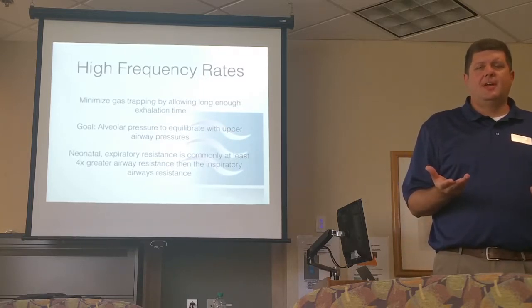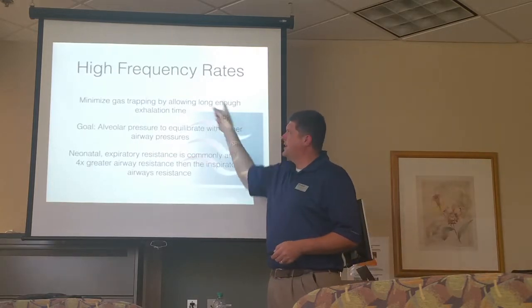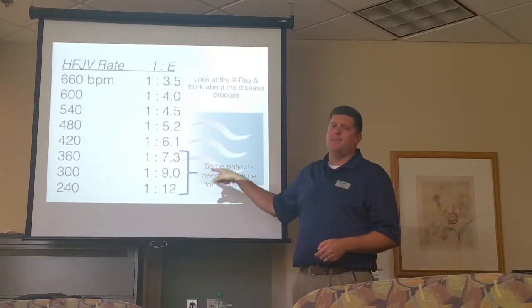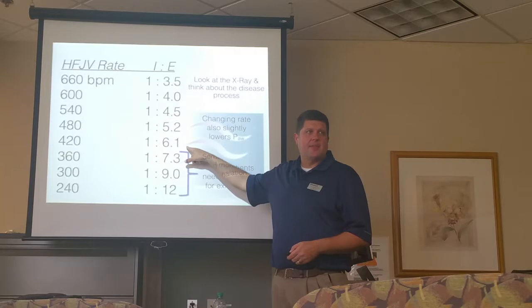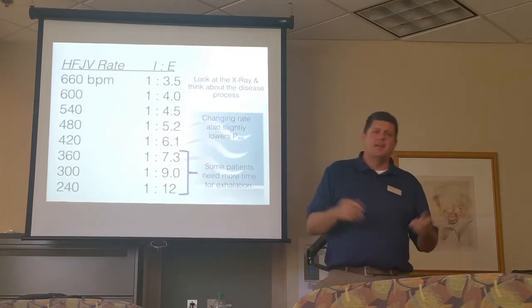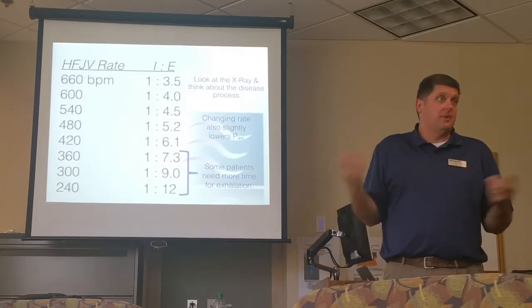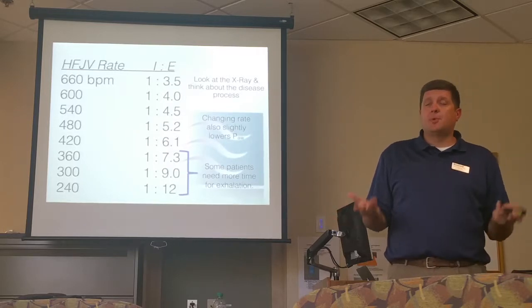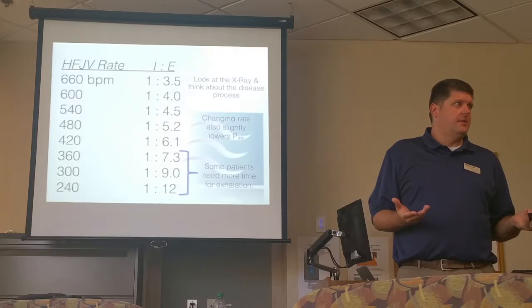Sure it does. Where the jet rate has an effect has to do with exhalation time. It has to do with making sure there's enough time for exhalation to occur. When you first turn the jet on, you're at this 1:6 IE ratio, right? It's just a middle of the road type thing. And that works well for most kids. A lot of times we don't ever have to change the jet rate, okay? But yeah, there are going to be times where it's really advantageous to change the rate and to lower the jet rate.